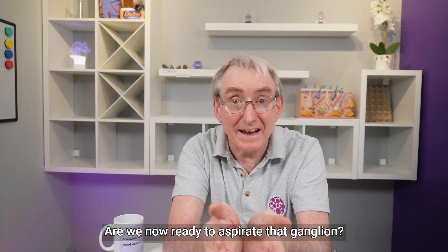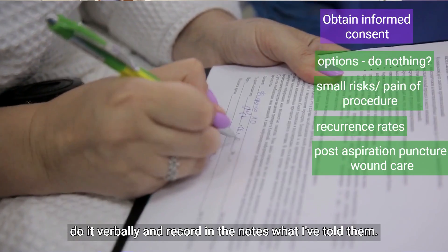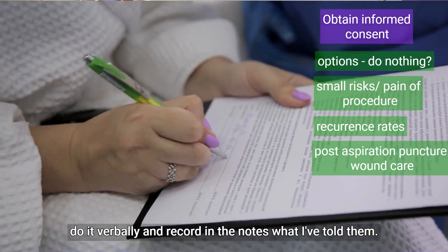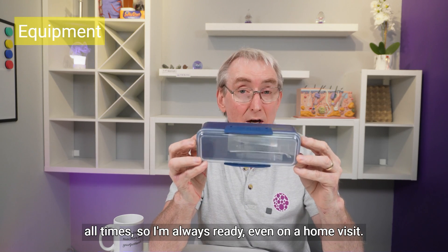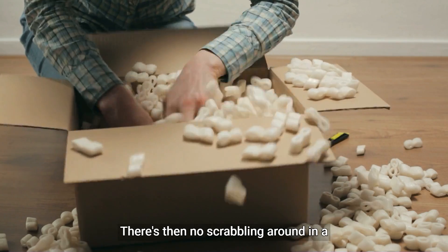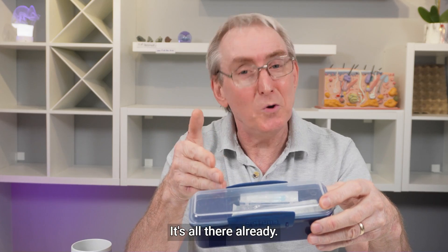Are we ready to aspirate that ganglion? Almost. Some people use a signed consent form if they wish, but I do it verbally and record in the notes what I've told the patient. I keep a plastic box with me in my medical kit at all times so I'm always ready, even on a home visit — there's no scrabbling around in a busy clinic trying to find what you need. It's all there already. I also use this kit for joint injections.